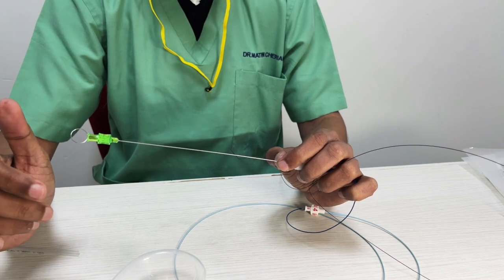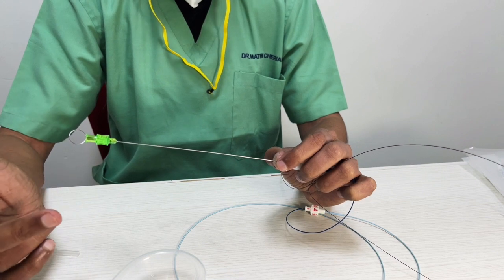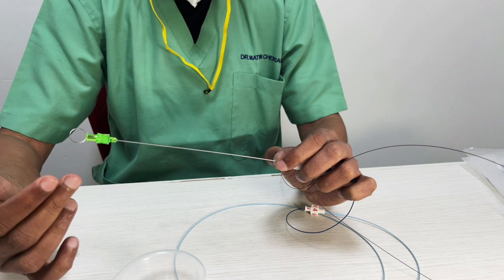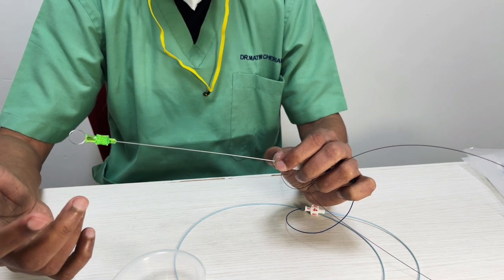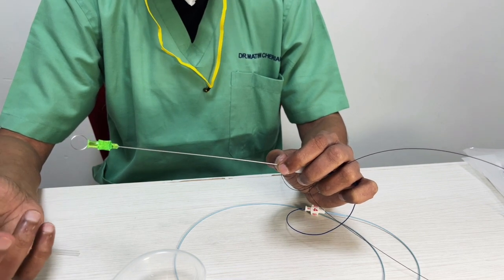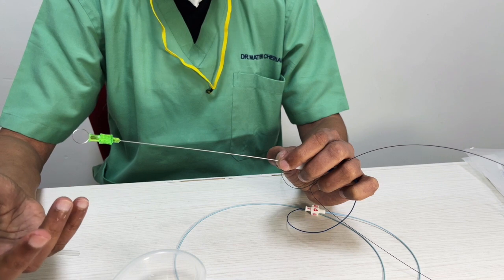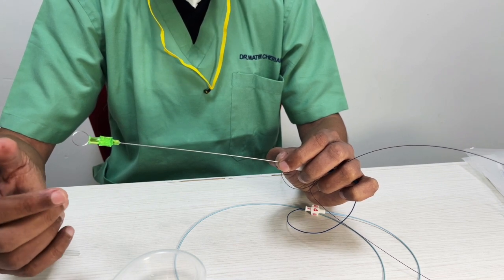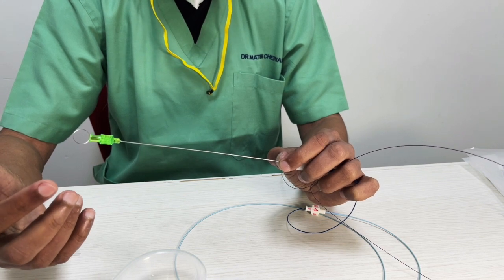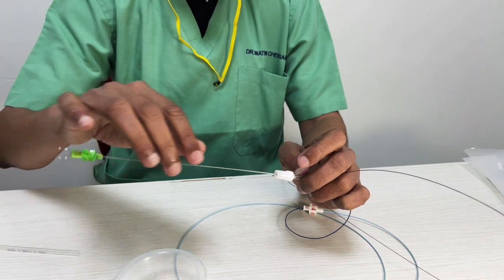Now remember, when you're using a 2.1 or a 1.8 microcatheter, the simplest way to deliver the coil is injecting it. Inject it using a 3 ml syringe under pressure, provided the distal part of it is in the safe zone. For example, if you're going to put this coil into a GDA and there's enough length, you can just inject it out. There won't be a problem. As long as you know it won't migrate very distally, it will work fine. Otherwise, you use the wire to push. So I'm going to show both.